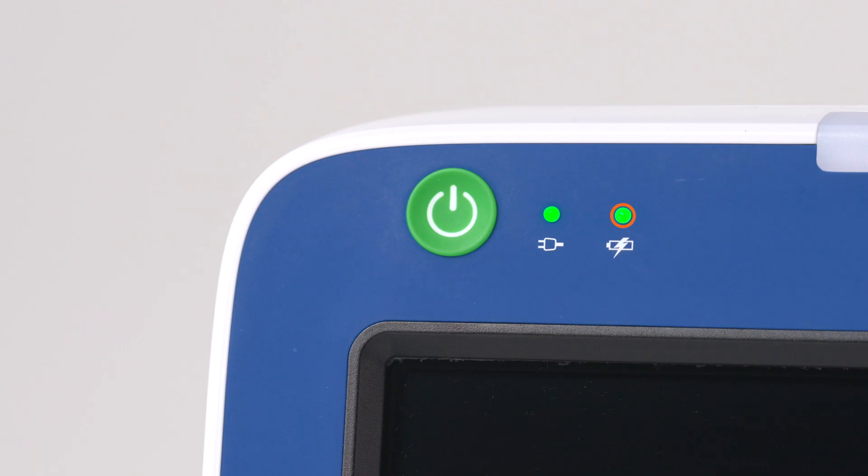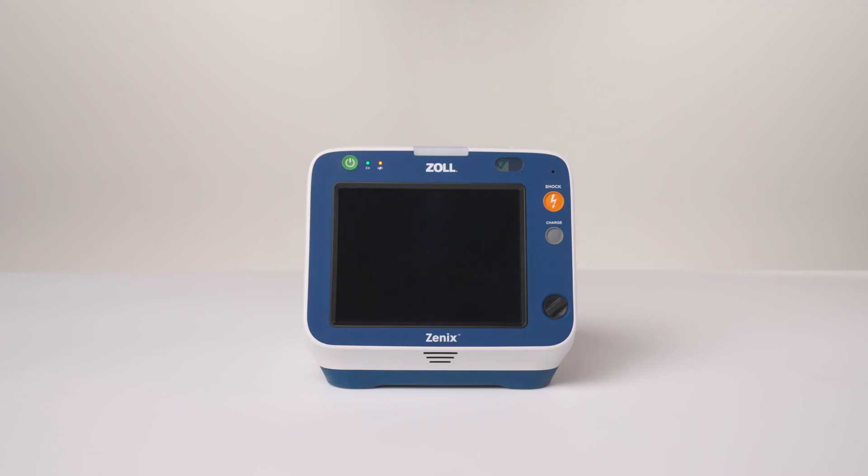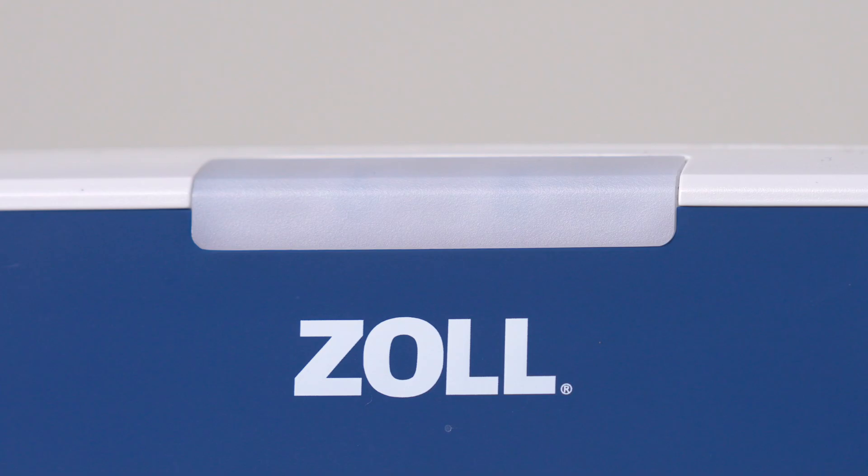Green indicates that the battery is fully charged. Amber indicates that the battery is charging. When the LED indicator alternates from amber to green, the battery is missing or has a fault, such as not being fully seated in the battery well.